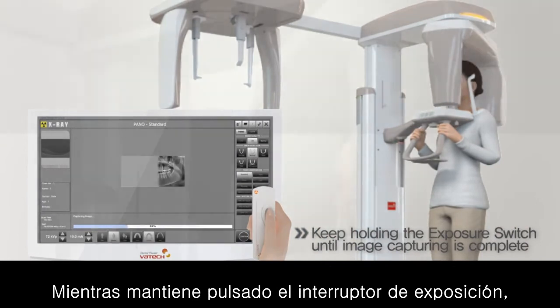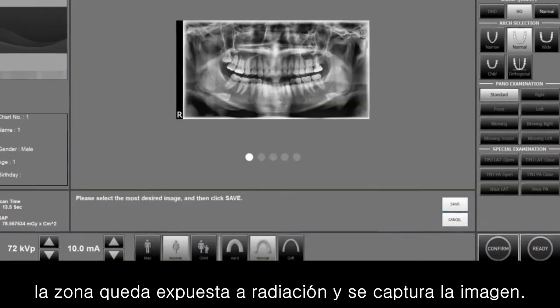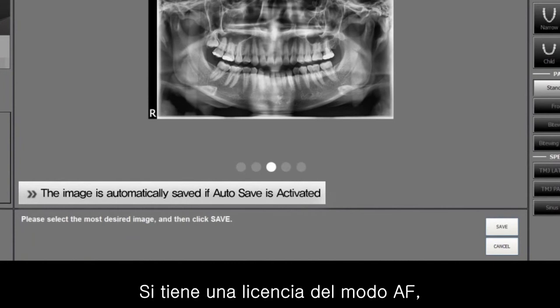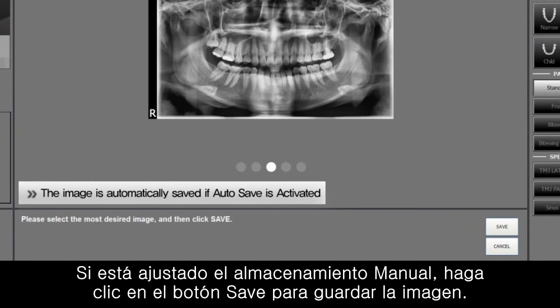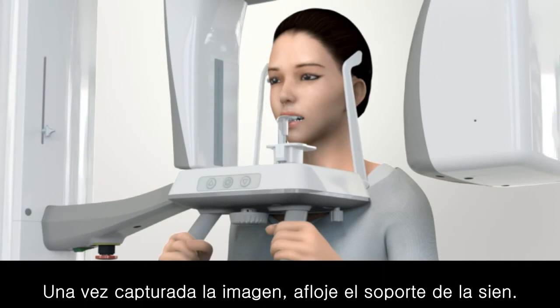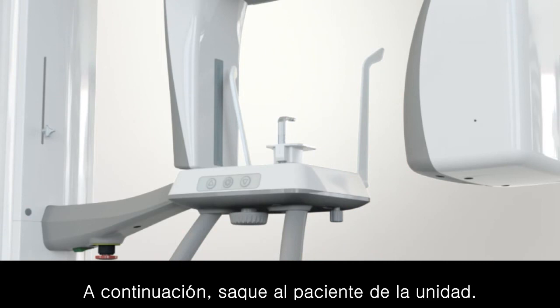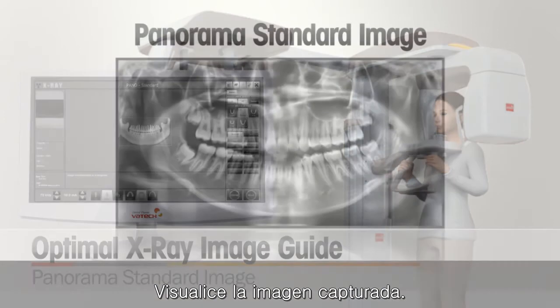While the exposure switch is held, radiation is exposed and the images are taken. After the image acquisition, save the captured image. If you purchased a license of AF mode, select and save the optimal image using the mouse wheel. If the manual save is set, click the Save button to save the image. After the image capturing, unfasten the temple support. Then guide the patient out of the unit. Check the captured image.